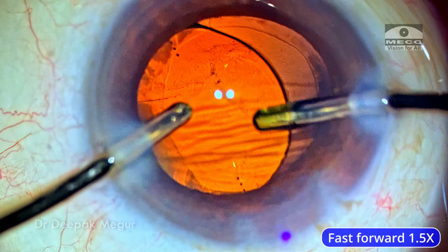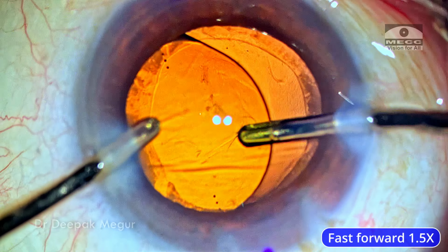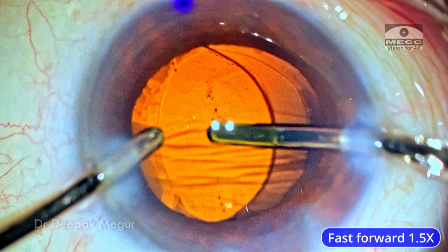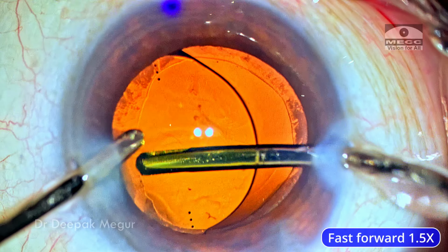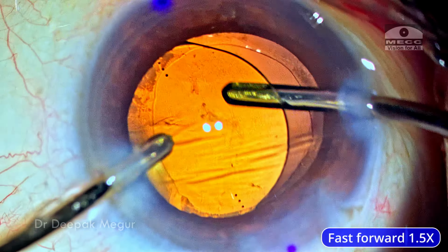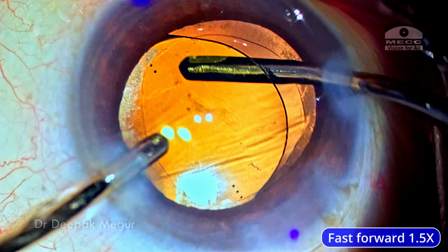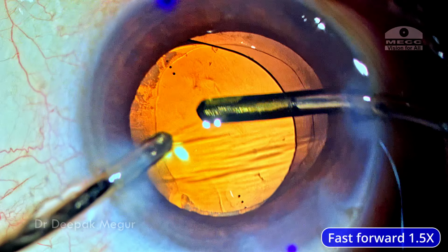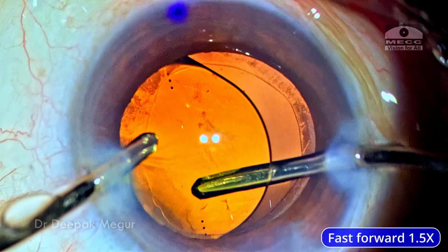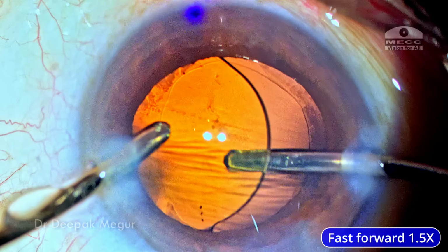Working with very low pressure does increase the surgical time because every step becomes a little bit slow, and it takes a slightly longer time to evacuate all the OVD both in front and behind the lens. And removing the OVD behind the lens is extremely critical. Since this is a toric IOL, we want the posterior surface of the lens and the bag to be totally devoid of OVD so that the lens contact is good and it sticks onto the bag very early.